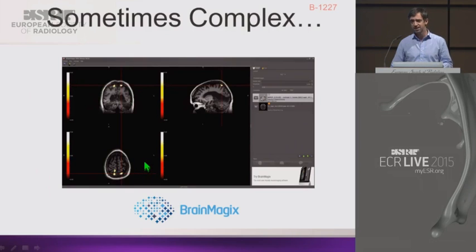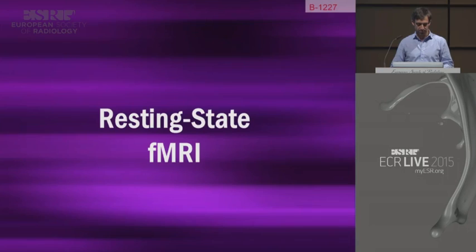And sometimes the interpretation is complex and the activations are not as nice as the ones that we can see in Science. Look at this patient, in our post-processing software, BrainMagix. We see some activation, but are they real activations or just noise? It's sometimes tricky to interpret.